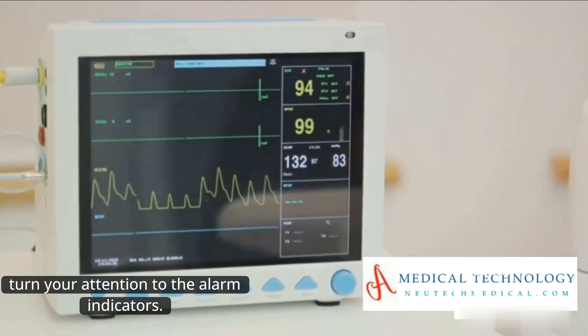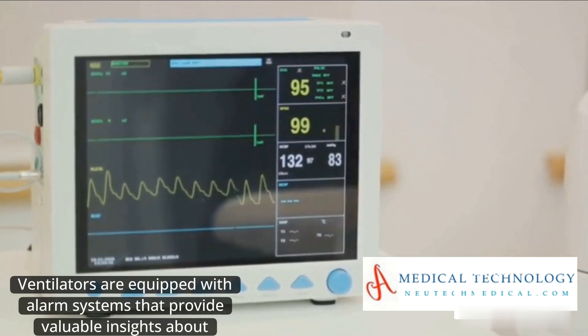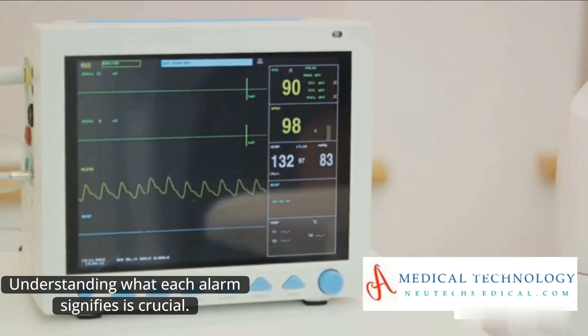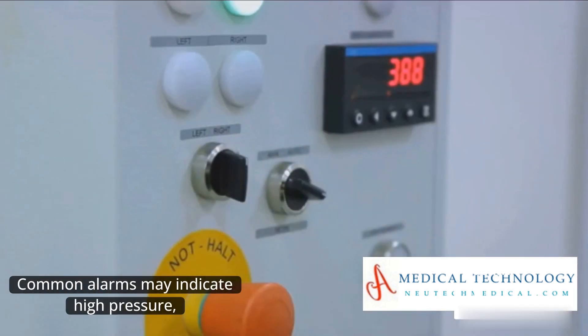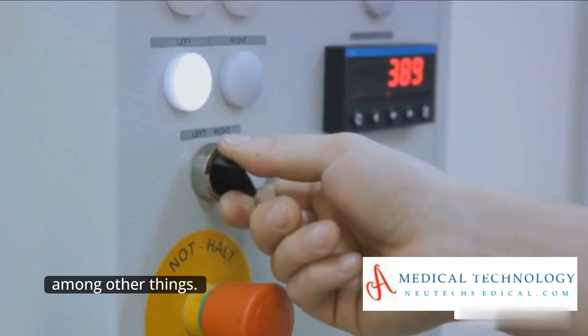Next, turn your attention to the alarm indicators. Ventilators are equipped with alarm systems that provide valuable insights about potential issues. Understanding what each alarm signifies is crucial. Common alarms may indicate high pressure, low pressure, or disconnection, among other things.